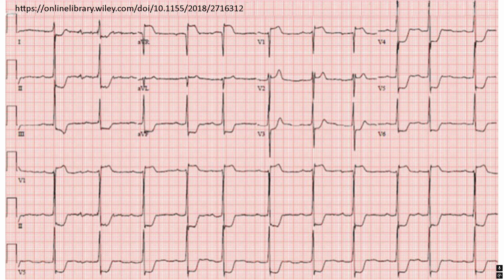So overall, my findings, if I was talking to you on the phone, I'd say I have a normal sinus rhythm, first degree AV block, normal axis and normal intervals. There appears to be J-point depression in multiple leads. So there's J-point depression in 1, 2, 3, AVF, V3, V4, V5, and V6, and there's J-point elevation in AVR and V1. I mean, even if you don't know the diagnosis, that's a STEMI. Like anyone who knows anything knows that's a STEMI. So that's how this whole process works, right?